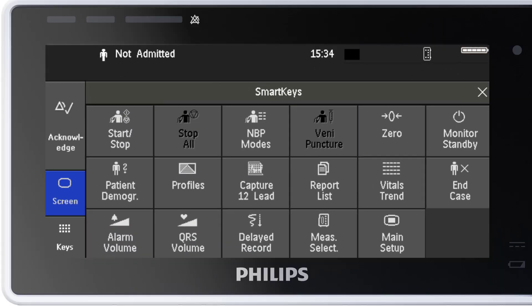Let me tell you a bit more about smart keys. They give you fast access to functions. The selection of smart keys available on your monitor depends on your monitor configuration. Here are some examples of common smart keys: to start or stop a non-invasive blood pressure measurement, zero an invasive pressure, view trends, or put the monitor in standby mode.